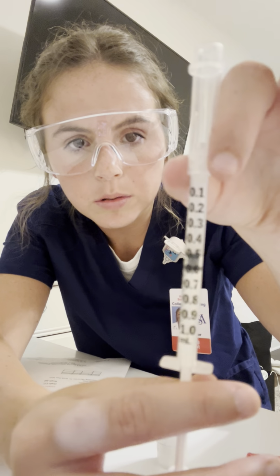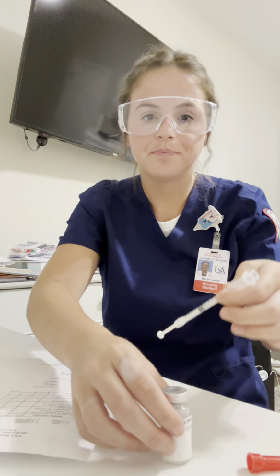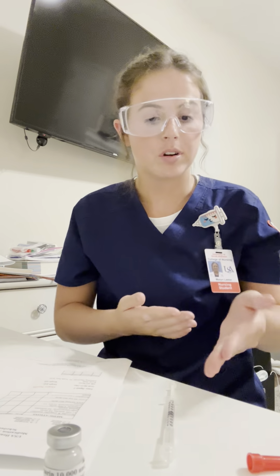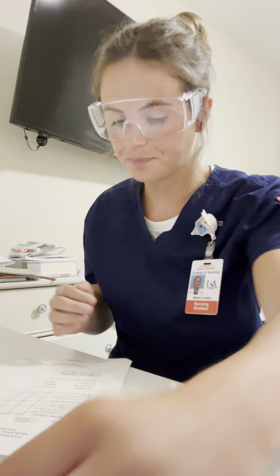There are no air bubbles. Okay. So we said the right time, right documentation is all elements of a legal prescription are included, and right indication is anticoagulant, and heparin is an anticoagulant. Okay, perfect.